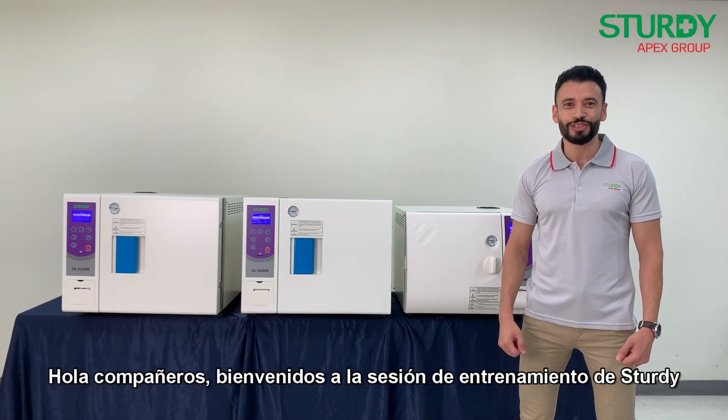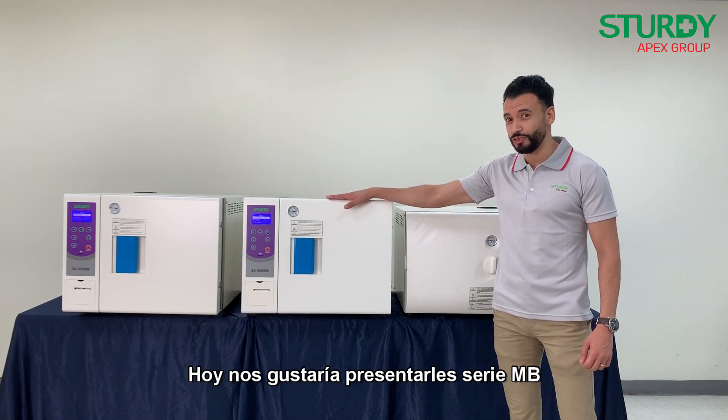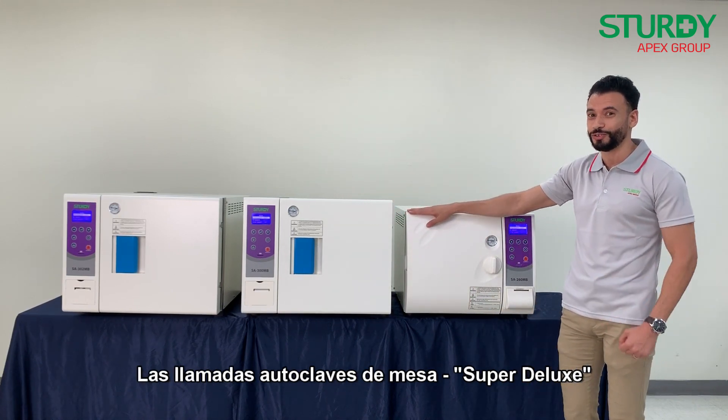Hello partners, welcome to the product trading session. Today we would like to introduce you to our MB series, the so-called super deluxe tabletop autoclave.